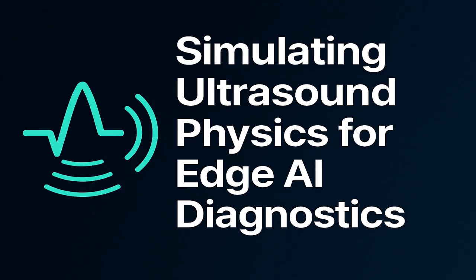It does. And the choice of PRF has a huge impact on clinical practice. Well, the PRF is limited by how quickly the signal can return, the round-trip time. So if you want to look deeper into the body, you have to wait longer for the echo, which means the PRF must be lower. And a lower PRF means a lower maximum measurable velocity. Right. So if the blood flow exceeds this limit, say during peak systole in a really narrow stenotic artery, the signal aliases, it wraps around. Meaning a high positive velocity incorrectly displays as a high negative velocity. Exactly. And that could potentially lead to a misdiagnosis of the flow direction or the severity of the stenosis.